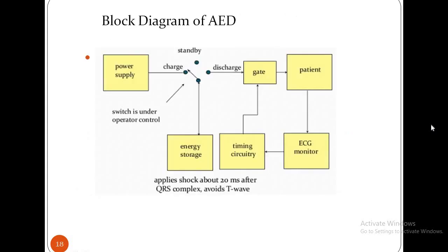The block diagram of an automatic external defibrillator is shown. The ECG monitor monitors the electrical signals from the heart, and if defibrillation is required, the charge stored in the capacitor is delivered to the patient.